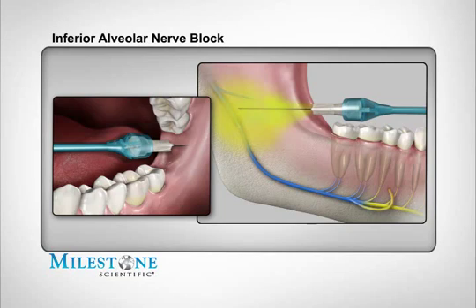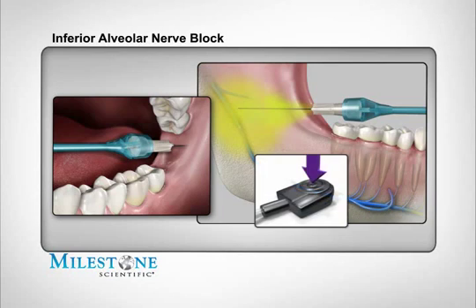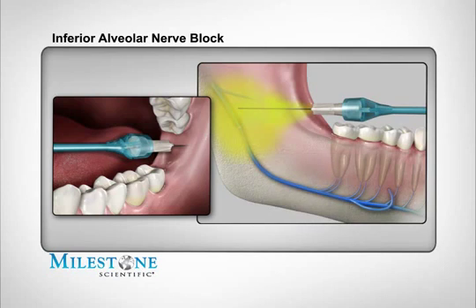It's recommended that the first 1/4 of the cartridge be dispensed using the control flow rate before transitioning to the second faster rapid flow rate. The rapid flow rate is used during block injections only after your patient has acknowledged that they have achieved soft tissue anesthesia of the area being injected. This is acknowledged by subjective statements elicited from your patient. When you've delivered the required dosage, you can remove the needle.